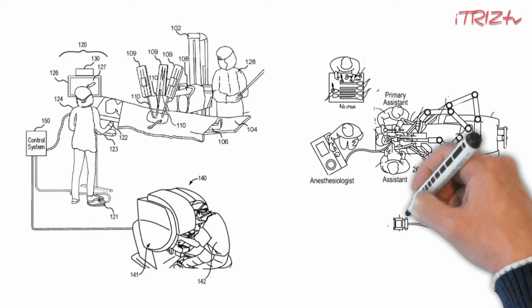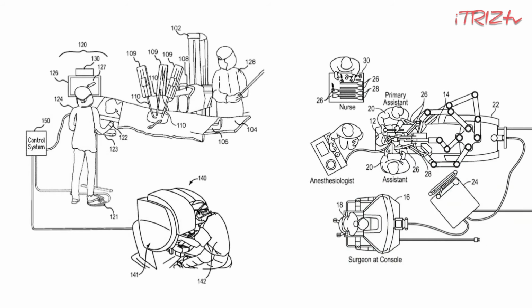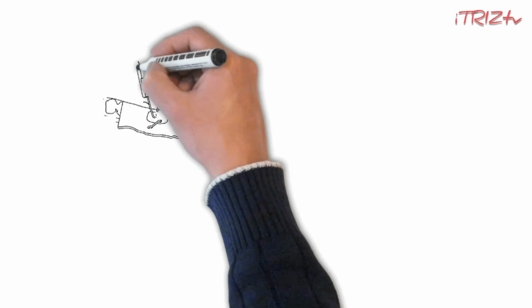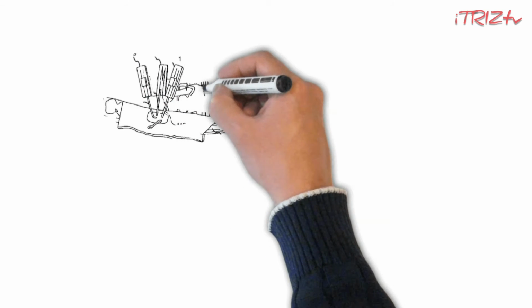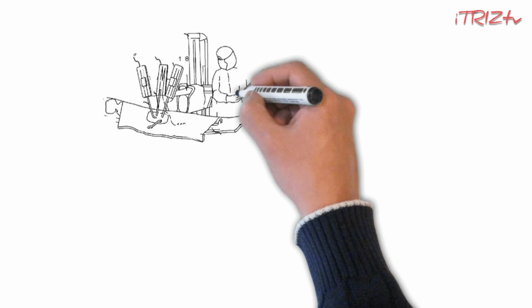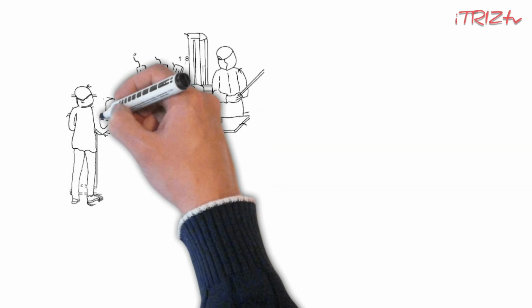Johannes Sebastian Bach was an organ virtuoso who was able to play a legendary solo by the pedals of the organ. It looks like the pedals of the Da Vinci control panel are not adapted for solo yet, because the most important operations are carried out by hands.